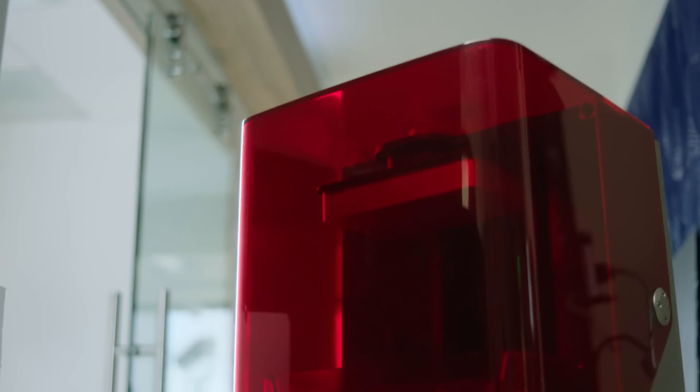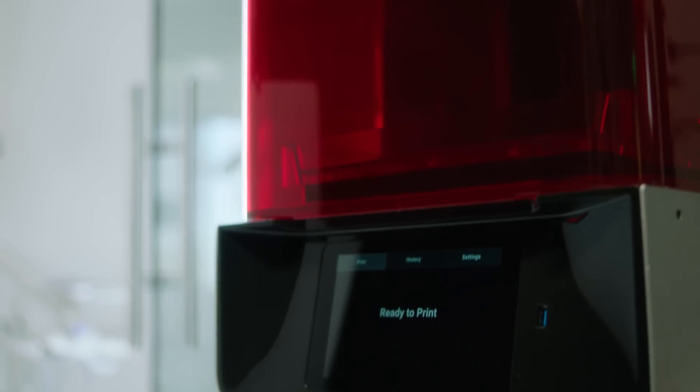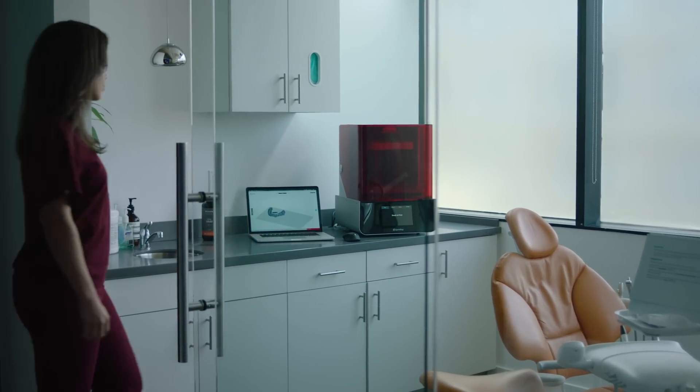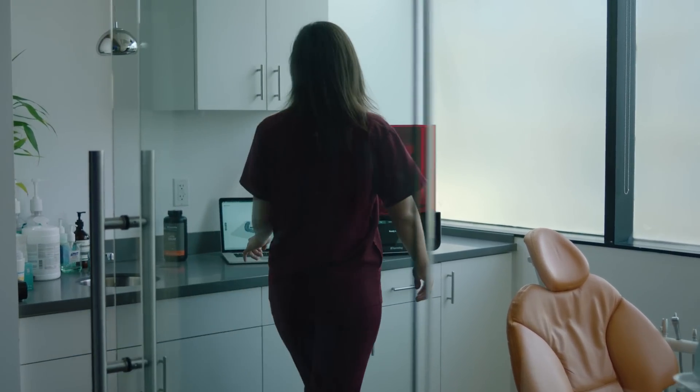Imagine being able to produce your own aligners, surgical guides, dentures, splints, and more right in your own office. Imagine the level of service and value you can provide for your patients when you control the timing and cost of so much of these procedures.